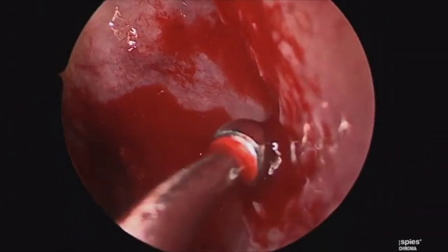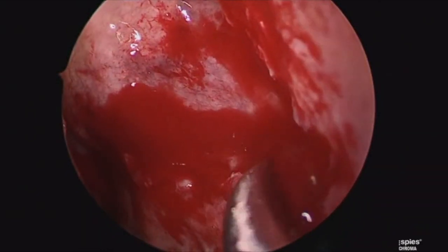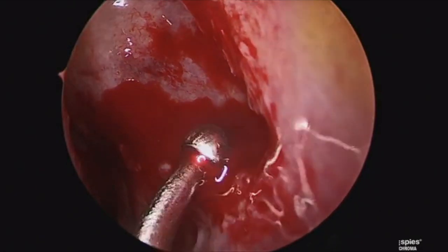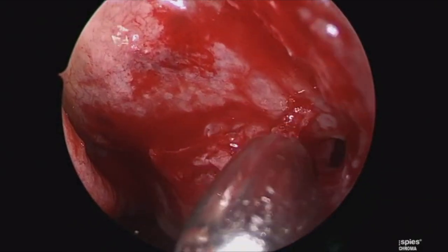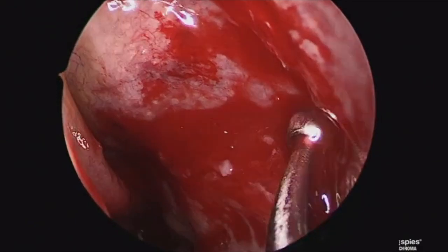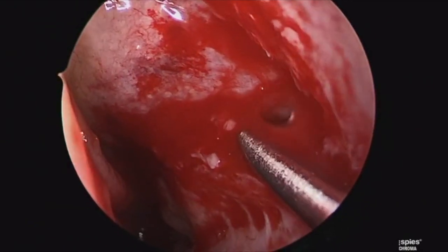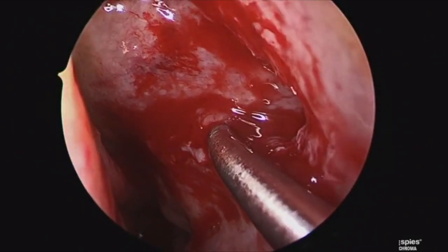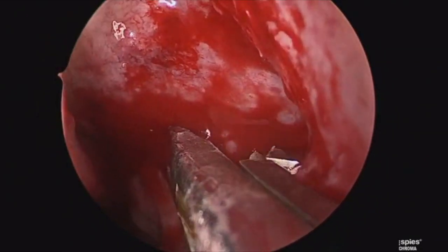Now we will begin to look for the natural ostium of the maxillary sinus. Here we are with a 30-degree endoscope, gently reflecting the inferior remaining portion of the uncinate, and then with suction we're carefully looking for this natural ostium. This is always in an off-midline or parasagittal position. Once that's identified, we then dilate it posteriorly with a maxillary ball seeker and then expand this more posteriorly with throughcutting instrumentation. Here are the straight throughcuts expanding that posteriorly.